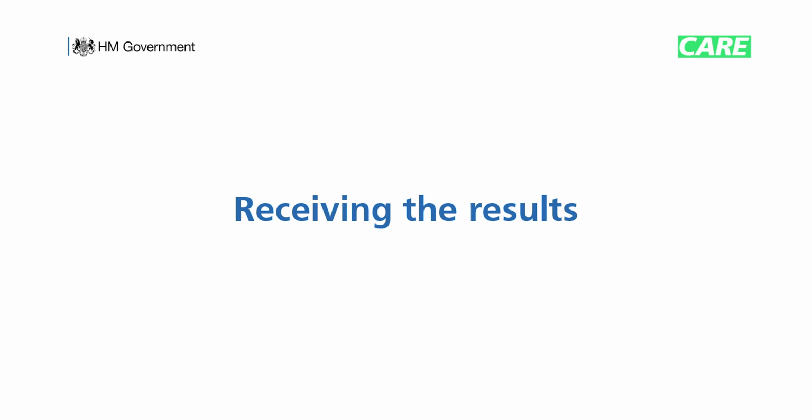You've now successfully completed the Care Home Resident Coronavirus Testing Kit, and you'll receive the results by email within 72 hours. Upon receiving the results, follow the local Public Health England guidelines on informing the person and, of course, providing them with support. Thank you for completing the training.